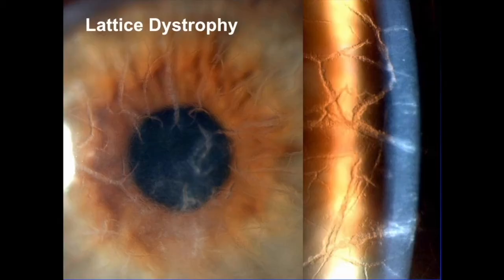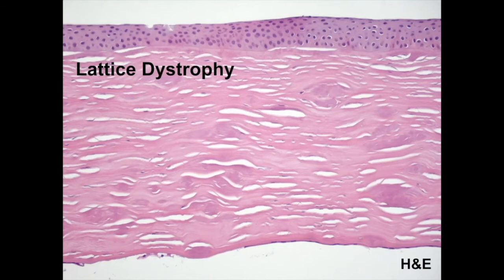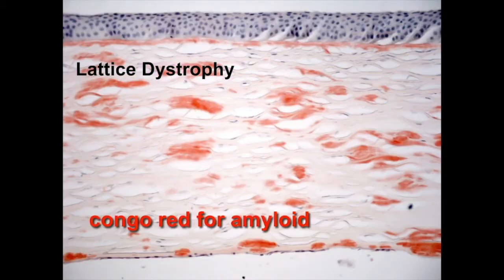In lattice dystrophy type 1, the TGFBI protein deposits out as linear deposits of amyloid. Of course, the stain of choice is the Congo red stain. Here's an H&E section. Deposits here are sort of amphophilic, a combination of basophilic and eosinophilic. Again, in contrast to the deposits in granular dystrophy, these have a smudgy appearance. They have smudgy margins. And here's a positive Congo red stain for amyloid.